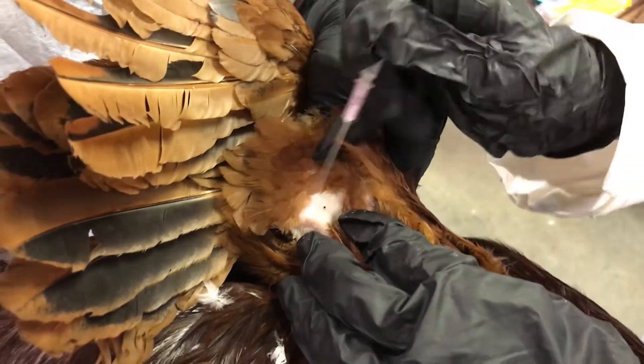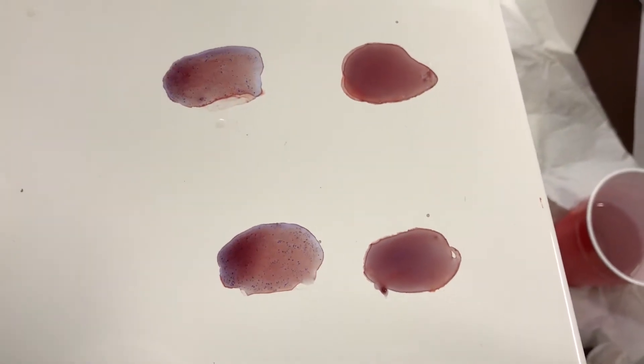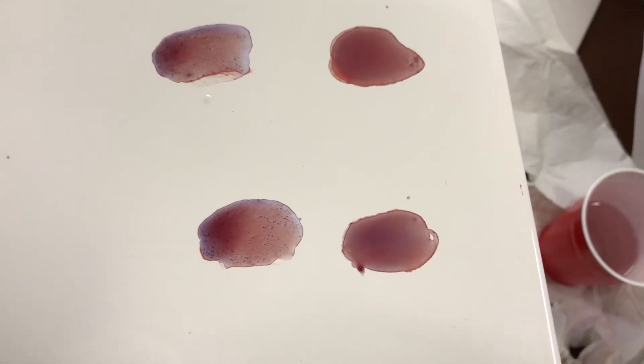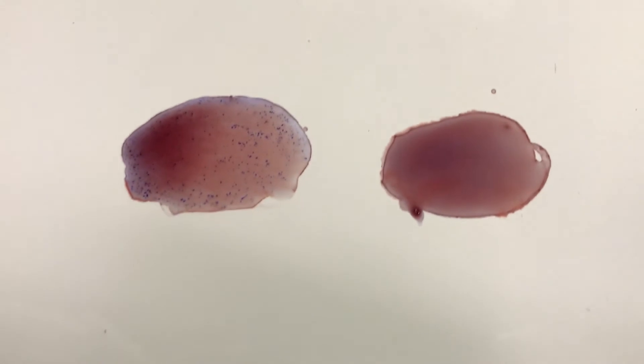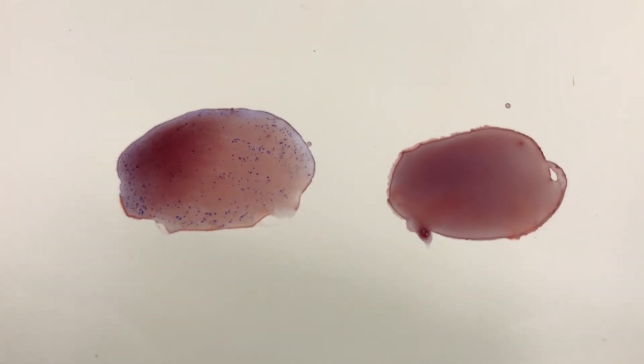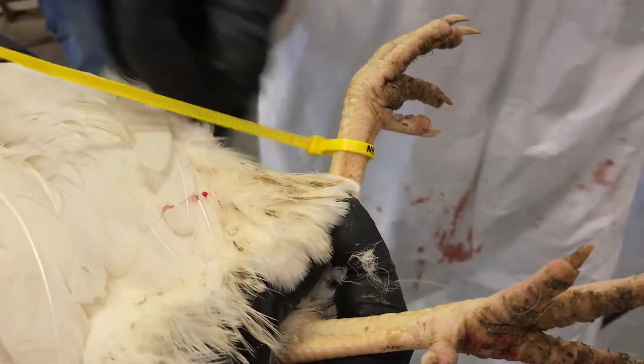No more than five birds should be tested at one time. A positive reaction will have small granules that fall through the test mixture when the plate is rotated. A negative reaction will be uniform in color with no evidence of clumping. Any agglutination identified after two minutes should be considered a negative test.